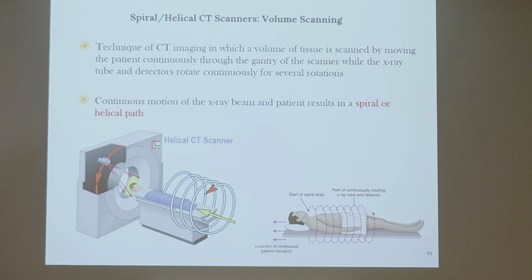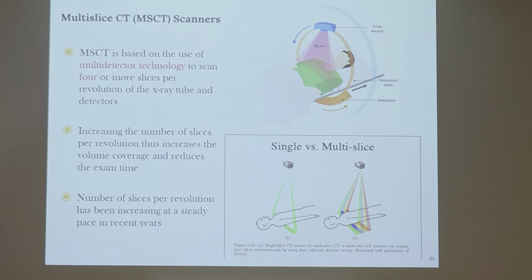They're just called multi-slice detectors. They're not necessarily called into a generation. It could be any of them. They're getting fancy with it. It's not identifying those, it's just calling them multi-slice scanners. And I think these are just the different versions that are coming into the generations. But remember, it's almost like package deals. What kind of equipment are you buying? iPhone 16, iPhone 12. What are the features that it has? Same brand, it's just different packages with it.